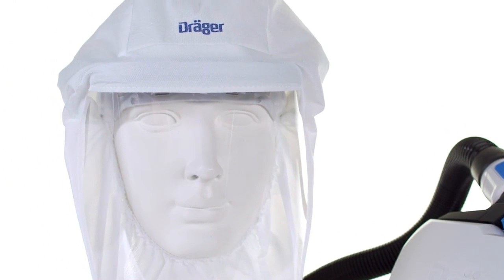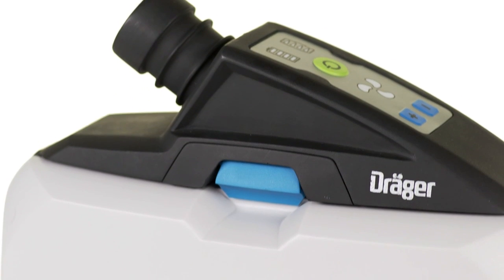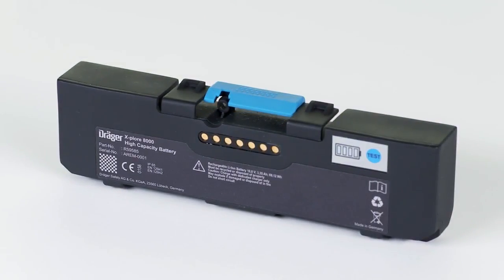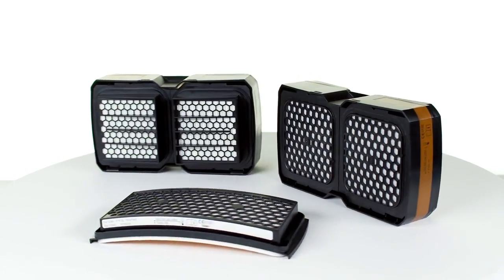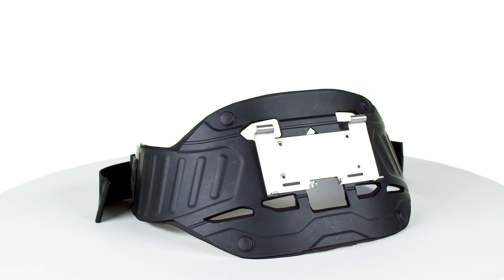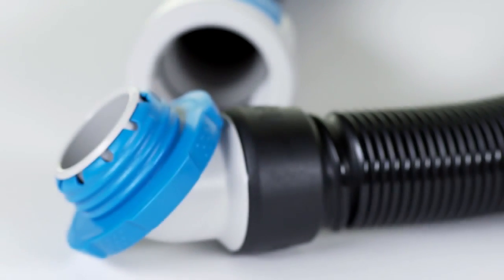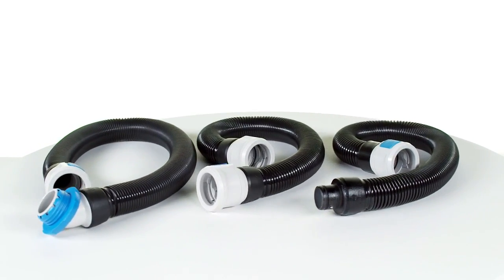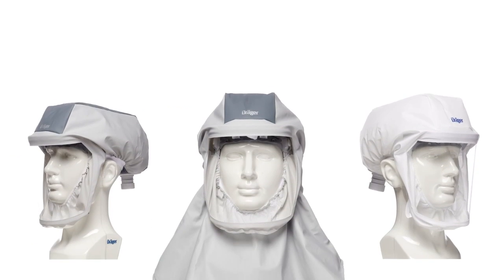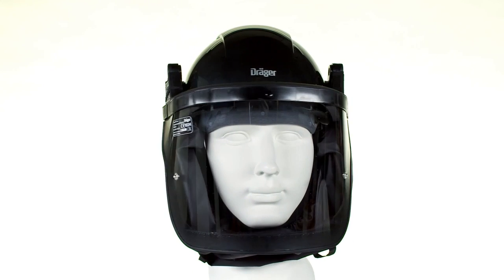The system consists of the following components: DREGA Explore 8000 unit, battery, particle, gas or combination filter, various carrying systems such as the Explore 8000 standard belt, standard or flexible hose with desired connection, and a facepiece — for example, hood, helmet, visor, or mask.